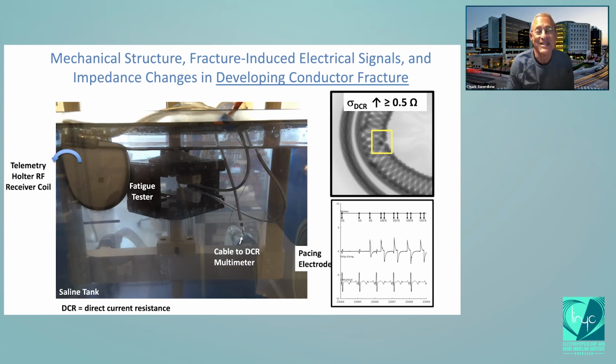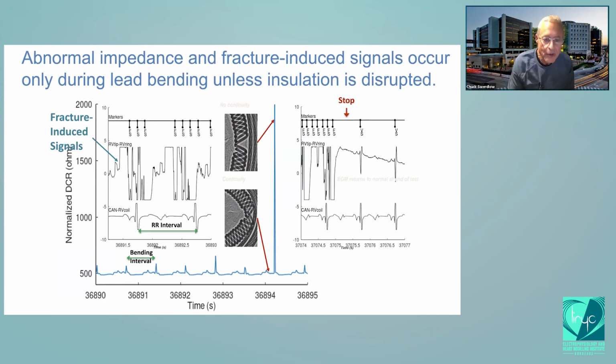And we made a lot of mistakes doing this, but we finally got it right. And so, for example, here you can see a completely broken lead.